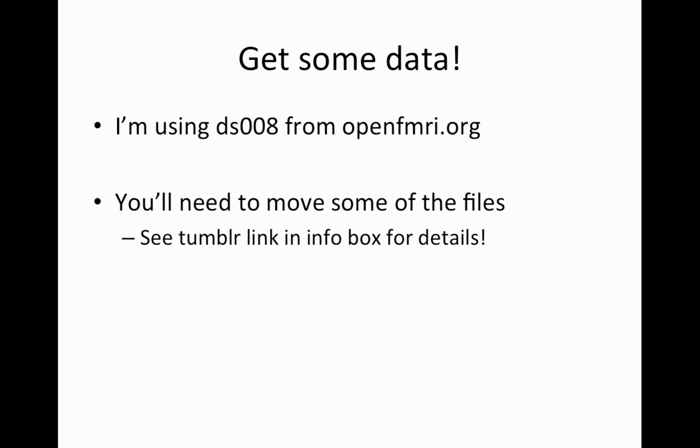So Russ has already created some of the files, and I would like to create them all from scratch and not rely on his files. There's absolutely nothing wrong with his files. It's just I want to be able to go through all the pre-processing steps with you. So you can go find that Tumblr and the Python script and run it, and it's just simply moving some files for you. So go ahead and do that.